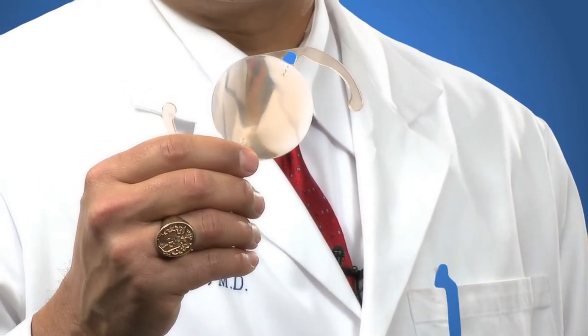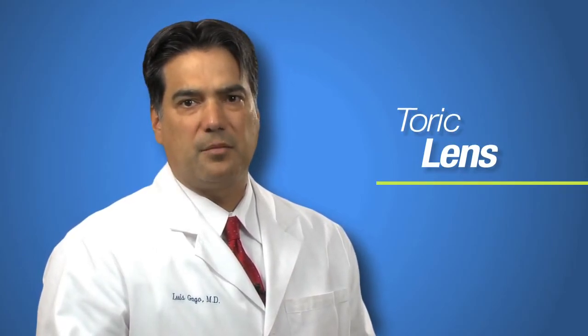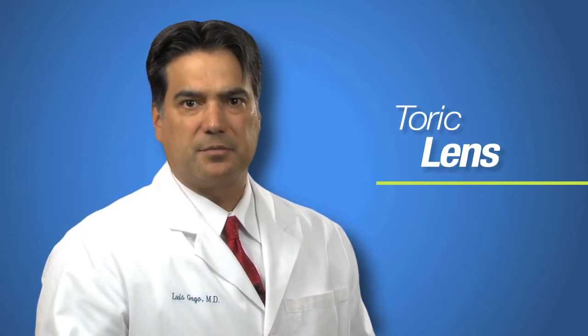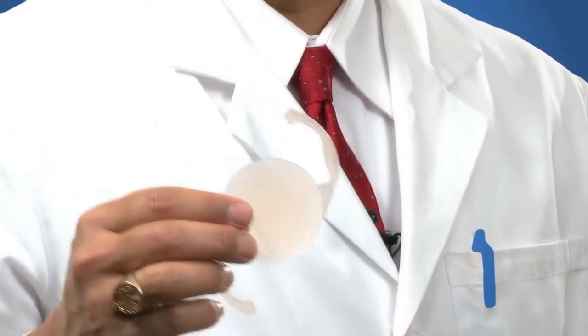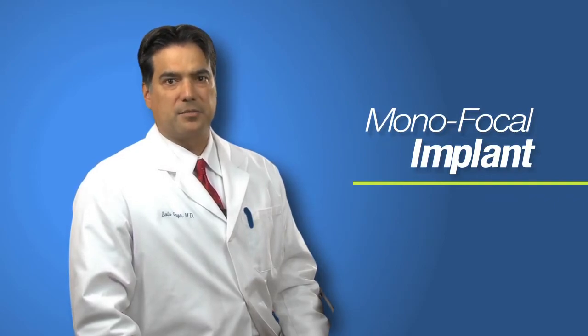The second lens option is the toric lens. It is designed to correct for corneal astigmatism. Astigmatism is caused when the cornea or lens cover of the eye is not round like a ball but more oblong like a football. The toric lens is designed to correct for the astigmatism, giving you better uncorrected distance or near vision. Lastly, there is the monofocal implant, which is designed to correct your vision for distance or near, but will not correct your astigmatism.